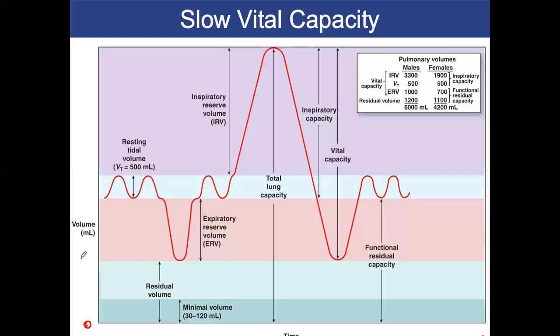I'm going to put 1 liter here, 2 liters, then let's do 3 liters and 4 liters, okay? On your spirometry data, it'll be labeled for you, so pay attention to what these units are.